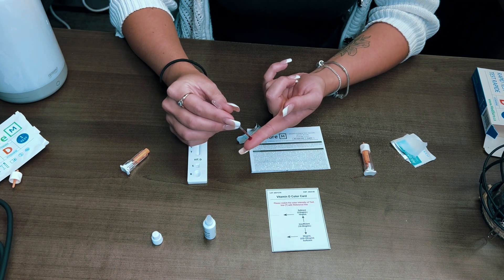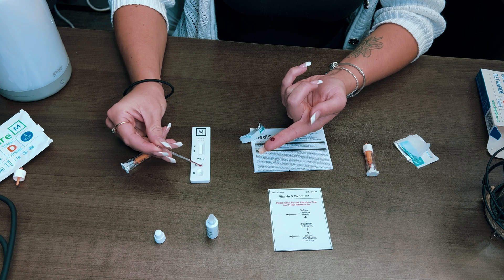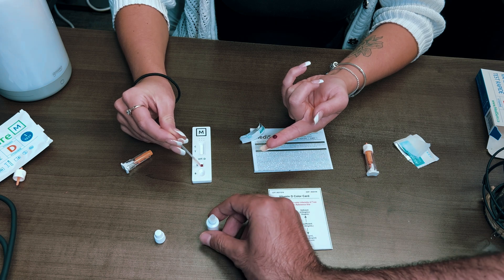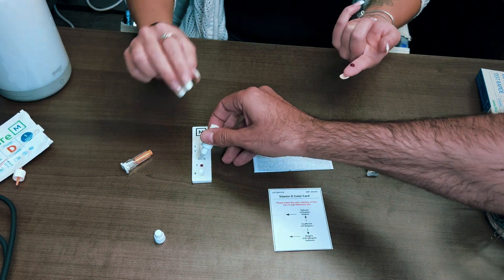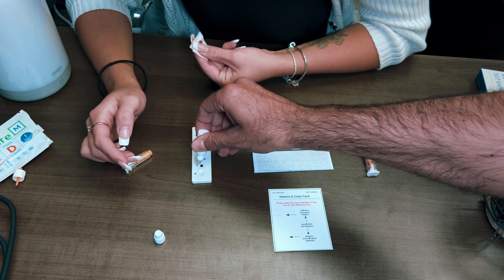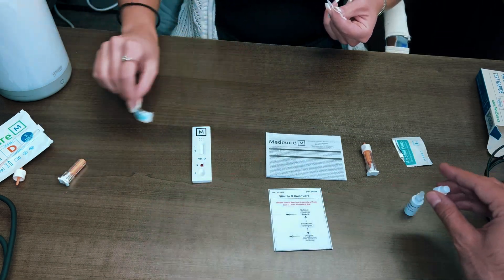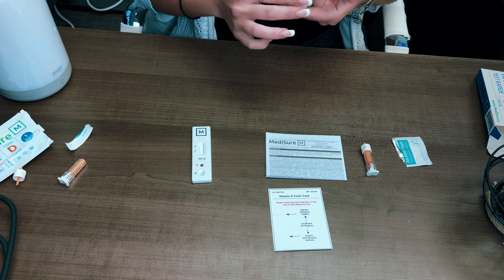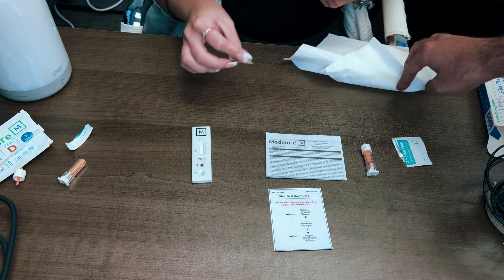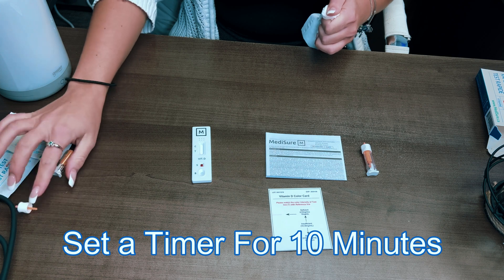Once filled, grab the capillary dropper and squeeze it — yes, now you squeeze — onto the test cassette, making sure you squeeze the blood into the S zone. After that, take the buffer solution, open it, and squeeze two drops into the B zone. Then wait 10 minutes — set a timer on your phone or just keep track — and you'll get your results.